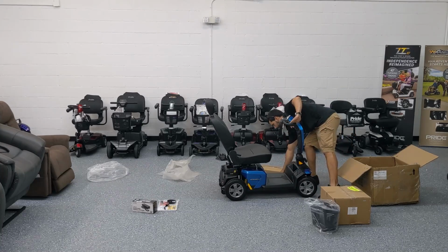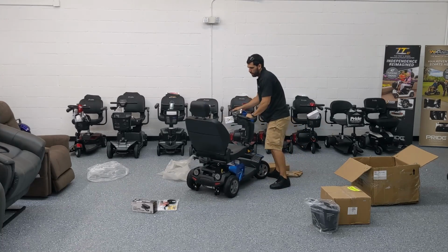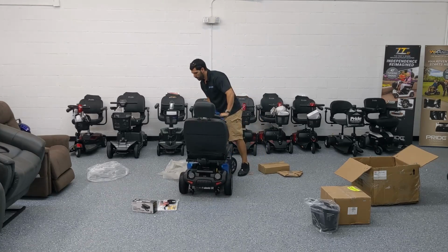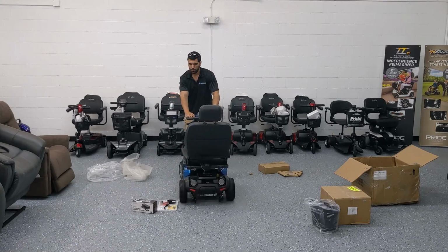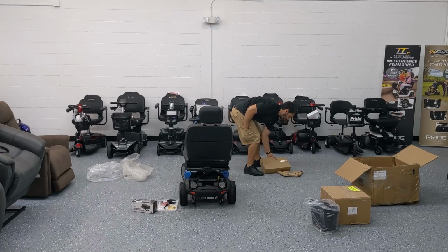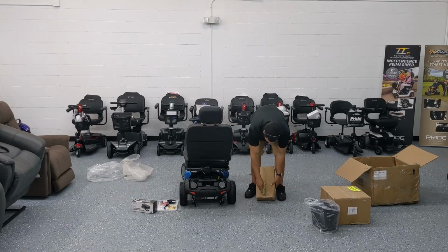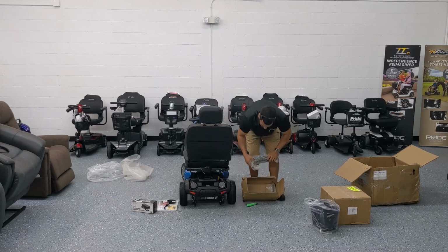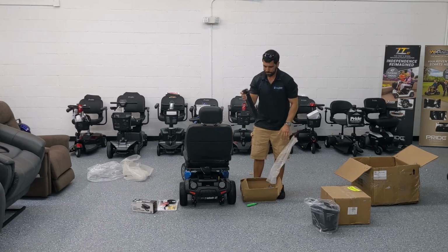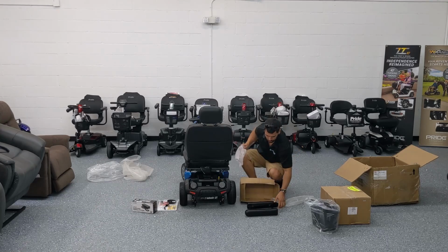I want to show you the back of the chair because we are going to have to assemble the armrests. The armrests that come with this unit basically attach right to the chair in the back. And we'll go over how to do that now. The armrests come wrapped up separately in this box, which you'll need to open. Here's one. And two.